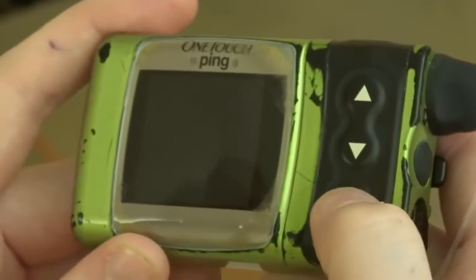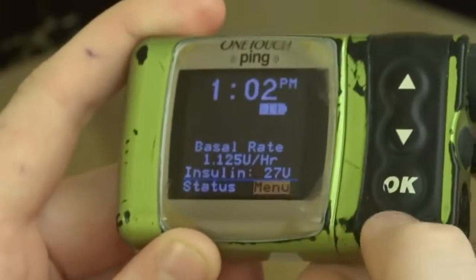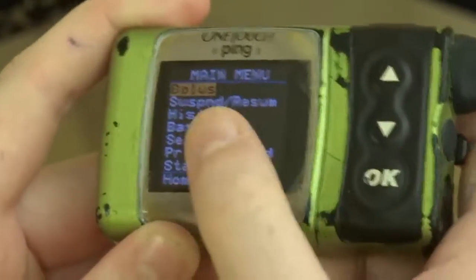I'm going to show you how to bolus on the Animus pump. You press okay to wake it up, go to the first menu, press okay, and go to bolus.